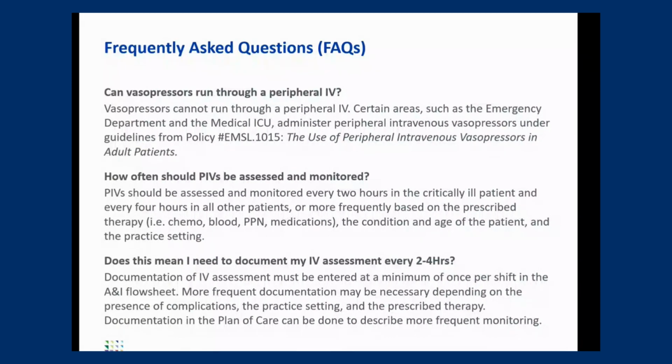So some frequently asked questions: can vasopressors run through a peripheral IV? So vasopressors cannot run through a peripheral IV except for the MICU and the emergency room. Those are two areas where we will run vasopressors peripherally, but generally we're going to get central access.